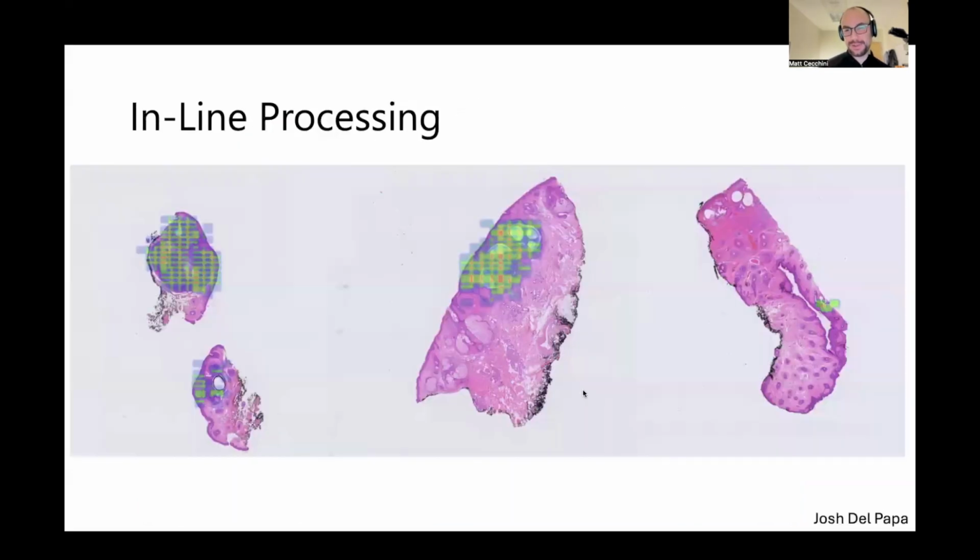And this is just some example cases here. So obvious cases, it's pretty obvious here. I think there's less value in these truly obvious cases of highlighting it, but this is the case that I think is really helpful. So this here has tons of hair follicles, right? Where it can be easy, you're hunting all around there, but it actually found a little tiny focus of BCC just right there, and these are the cases it helps with, right? Where you're hunting through all the tissue for that little focus in amongst all these hair follicles and everything. And there's a chance that you might miss it.